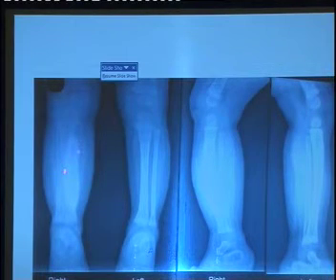Any other thing? Osteomyelitis is one. You see, there are a lot of periosteal reactions. If I had X-rays of other bones, I could show you. Yes, Caffey's disease. And one more differential diagnosis will come. What is that? In children, even a battered child might be, but other things: some deficiency, one vitamin deficiency, scurvy, subperiosteal hemorrhage. Okay, that will mimic a similar picture.